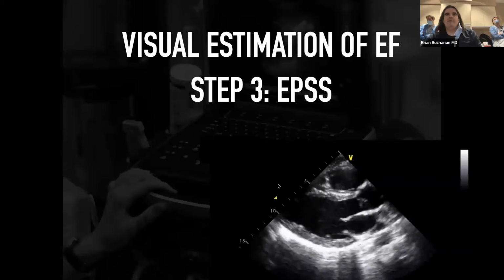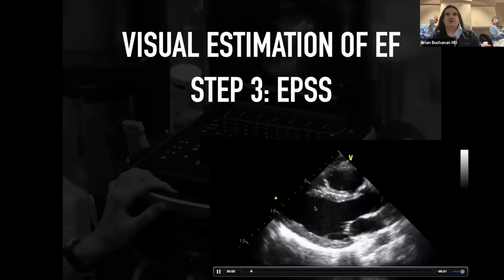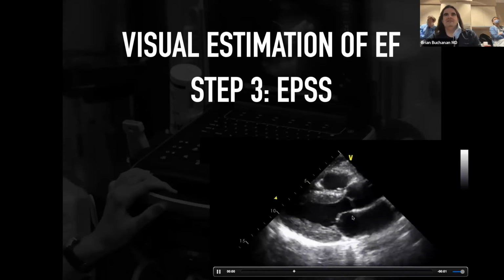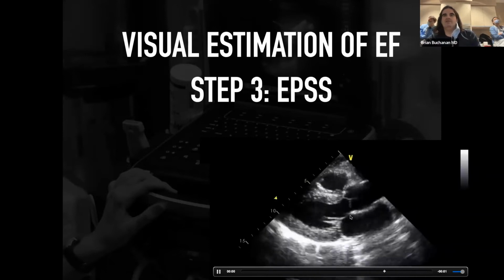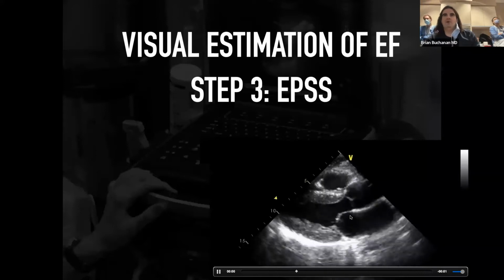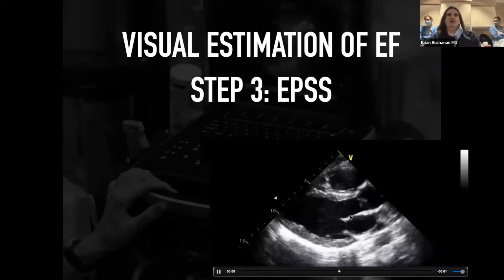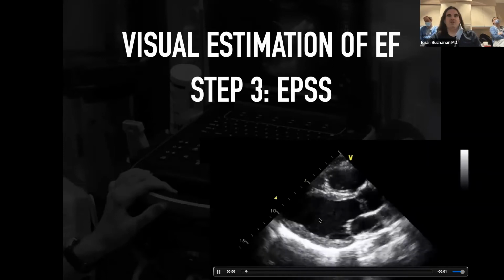The other thing that people often will talk about is what's called the EPSS, or E-point septal separation. So basically this right here is the mitral valve. That's the anterior leaflet, take my word for it. That's the posterior leaflet. But this anterior leaflet is opening up during diastole. And with a normal cardiac output of bulk flow, those leaflets have good excursion. They come fairly close to the septum, which means that the LV probably has relatively good cardiac output. It's preserved, and the function is decent.